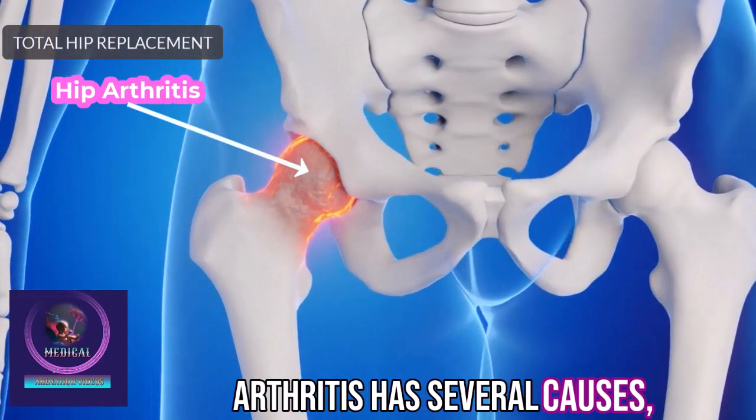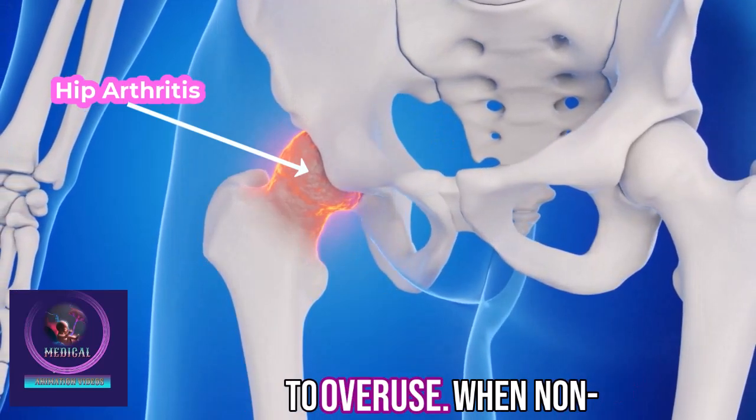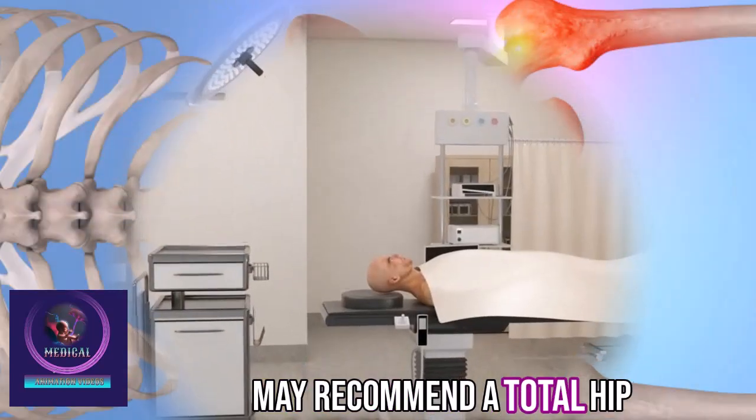Arthritis has several causes, but it commonly stems from cartilage deterioration due to overuse. When non-surgical treatments are no longer effective, your doctor may recommend a total hip replacement.